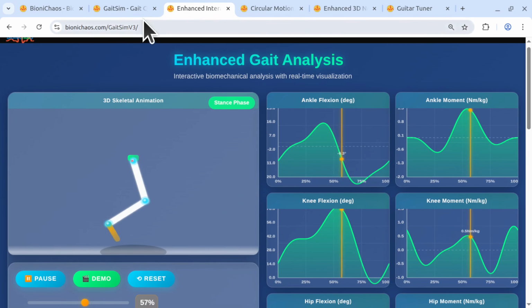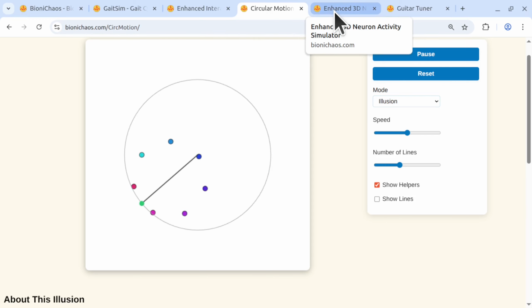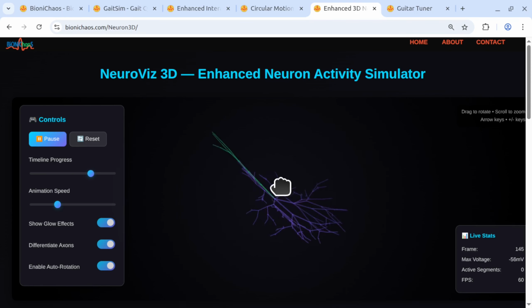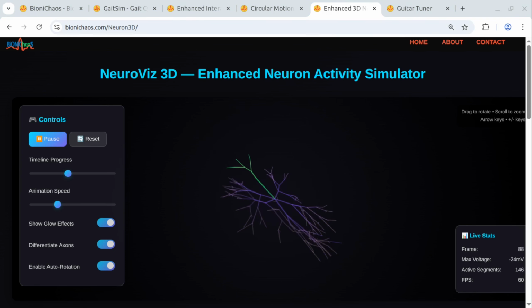Okay, so we covered this, we covered that. That's now version of the thing. Well, very different, but you know what I mean. Gait related. Yeah, we have this one as well.